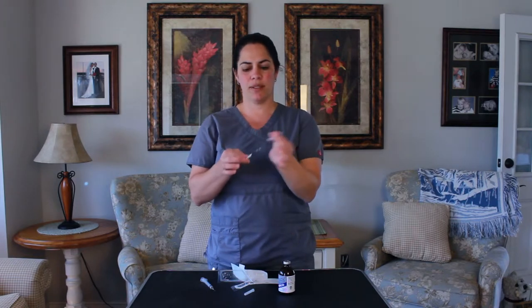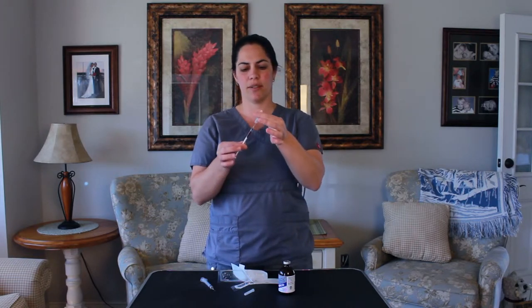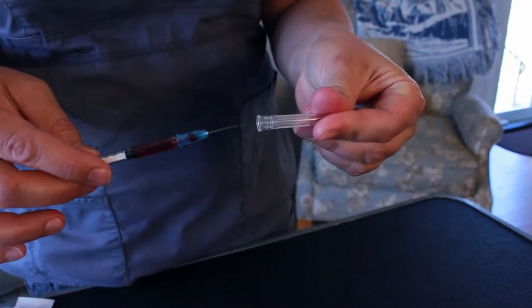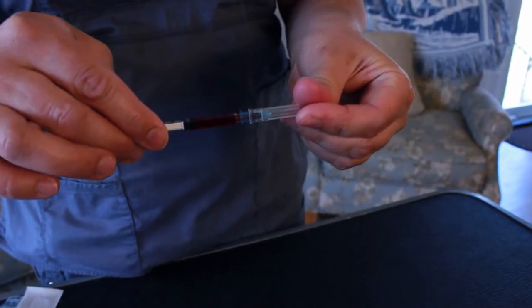When you recap your needle, you have to be very careful to recap it straight. If you go to the side, you can go through the cap and puncture your finger. So be careful when you're recapping.